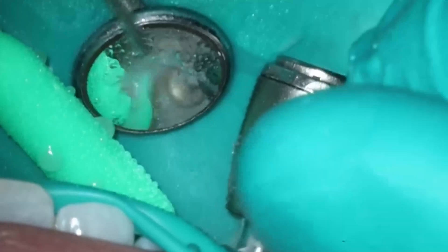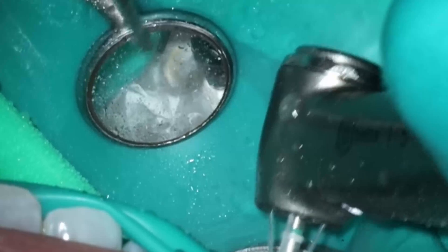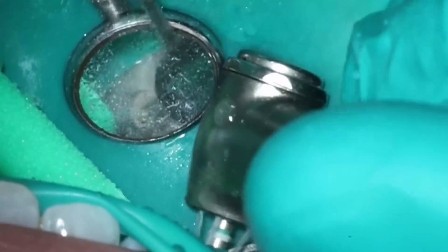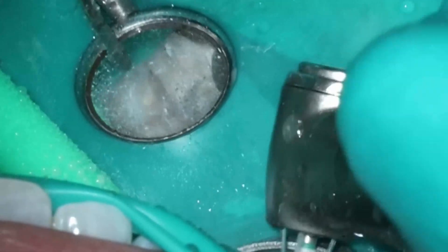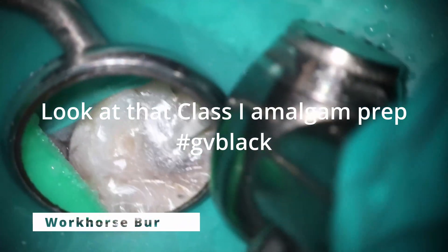This tooth is going to need a crown, so the first thing we're going to do is flatten it out like normal. Something I haven't talked about before — I've noticed sometimes when I'm starting to flatten the teeth, you'll actually drop into the decay, stuff that you may miss normally because it's kind of underneath the cusp tip. You can see the decay already starting to show through here.